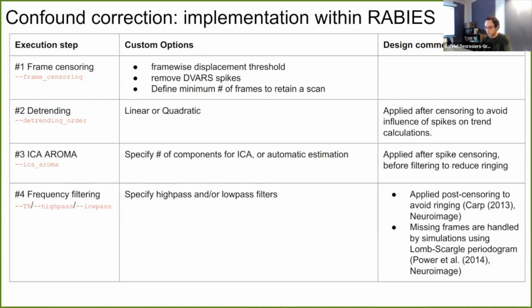And right now in the literature, unfortunately, there's no ground truth for how we're supposed to correct for confounds because there's all sorts of technical problems involved. And unfortunately, it's the state of the literature where different labs have different ways of correcting for confounds, and there's no absolute protocol for how you're supposed to do this. But hopefully the tools I'm going to present later will support your decision in that respect.